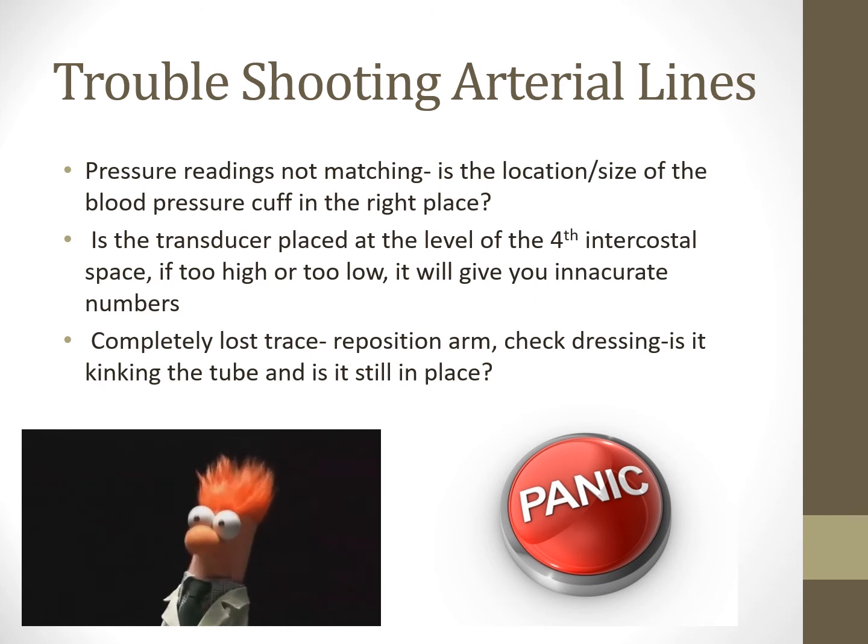If it's too small and you got this ginormous 6'5" individual, then you're going to have an overestimation of manual blood pressure on these patients. Just like ET tube sizes, you need to make sure that the manual cuff is also the right size for the right patient. Obviously, this gets very important when we look at neo and pediatrics as well, but in adults, that can happen from time to time. Not as common, but from time to time.